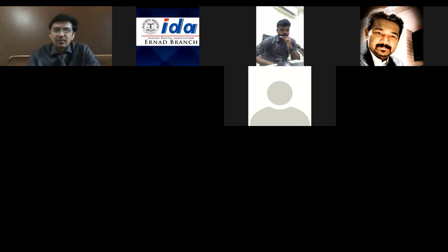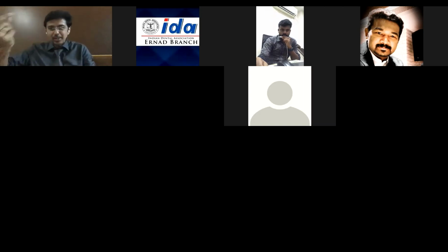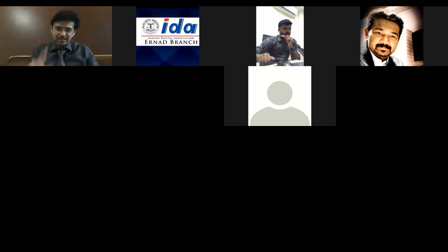Shorter abutment. With regard to less interocclusal clearance, always and always go for screw retained rather than cement retained. If you give cement retained again and again, the prosthesis would be coming out. One of the major indications of screw retained is actually smaller clearance. Are you getting it? Screw retained only. So I wouldn't advise going in for shorter abutment at all, Dr. Gajanan. My advice would be to go in for only screw retained.